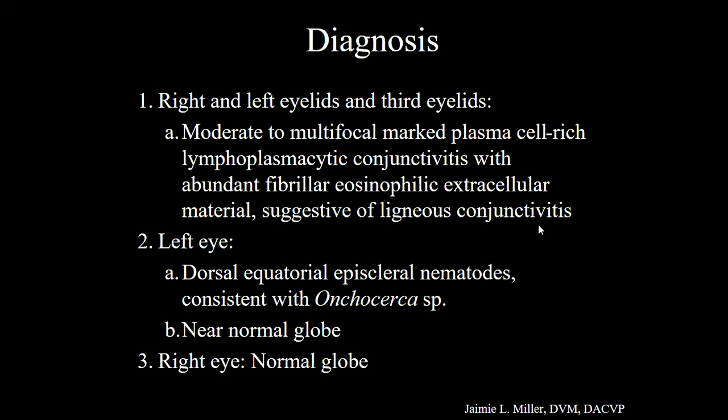Then do they sample any other tissues from this dog, like kidney or mucosa? Not that I know of. And again, they said no systemic signs at time of diagnosis or even during the treatment, because sometimes it'll continue to progress even with some treatment.